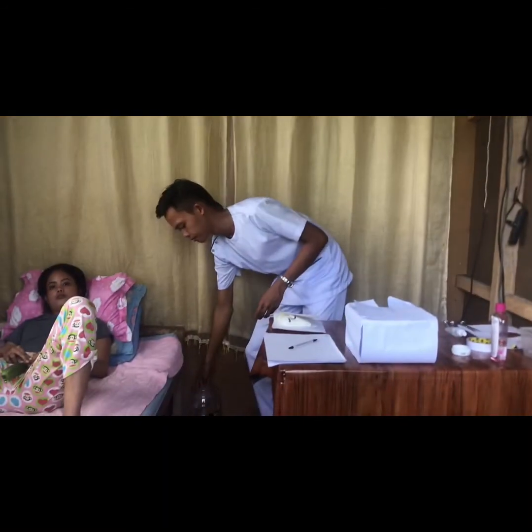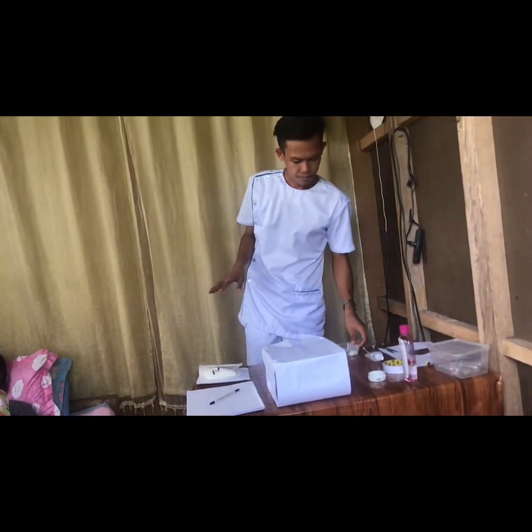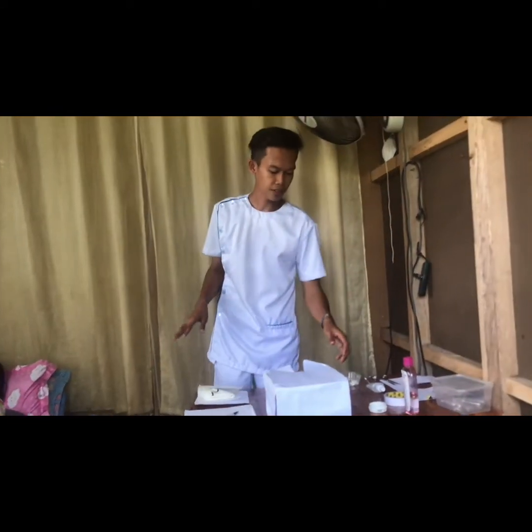So now we are already done performing the pericare. I'm going to remove my working gloves, and then we're going to throw them immediately in the garbage. So the next thing that we're going to do after we perform the pericare is to open the catheter kit.